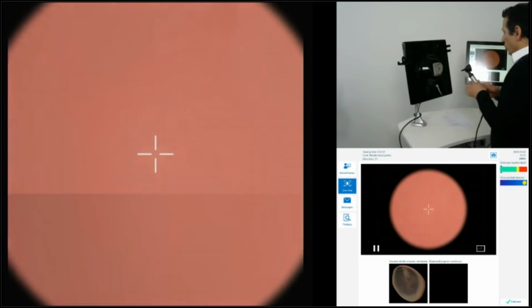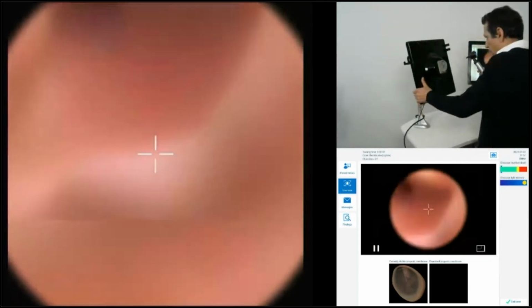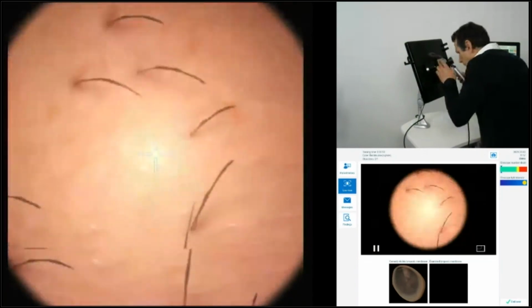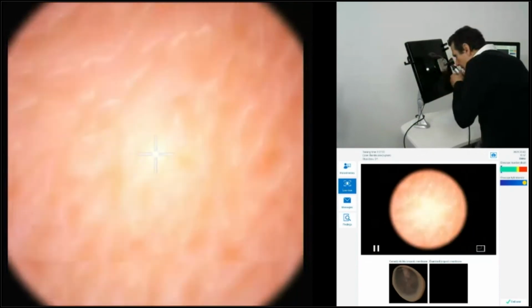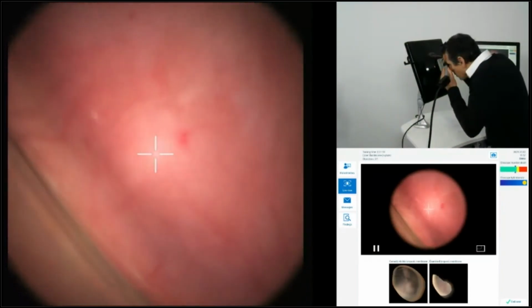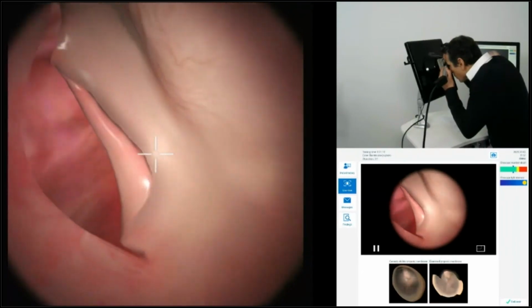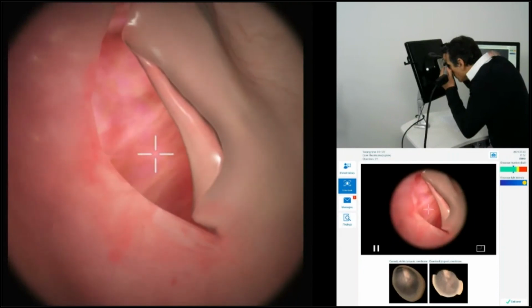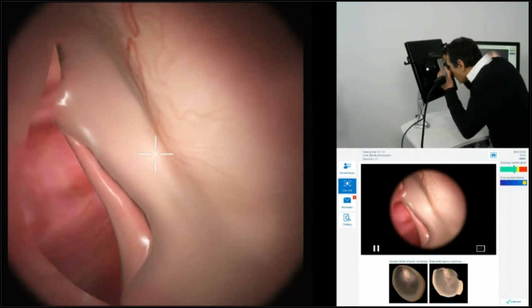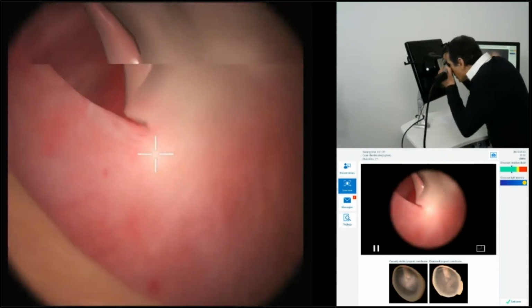And then when I approach the ear, you can see immediately that the system realizes that I'm starting the examination. So see, when I go to the external ear, I can see that it is all being tracked. And now I want to examine the inner ear, so I'm pulling the ear a little bit here. And here we go. Yeah, and that is the perforation. So I can see the perforation in the tympanic membrane. The rupture is clearly visible, and I can examine the whole ear.